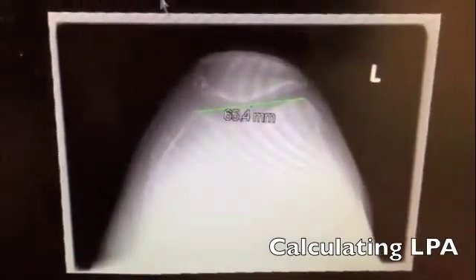What they did then was that they took an angle that started its base along that line and then proceeded up the lateral facet of the patella. You can see in this example that the patellofemoral angle is 11 degrees.